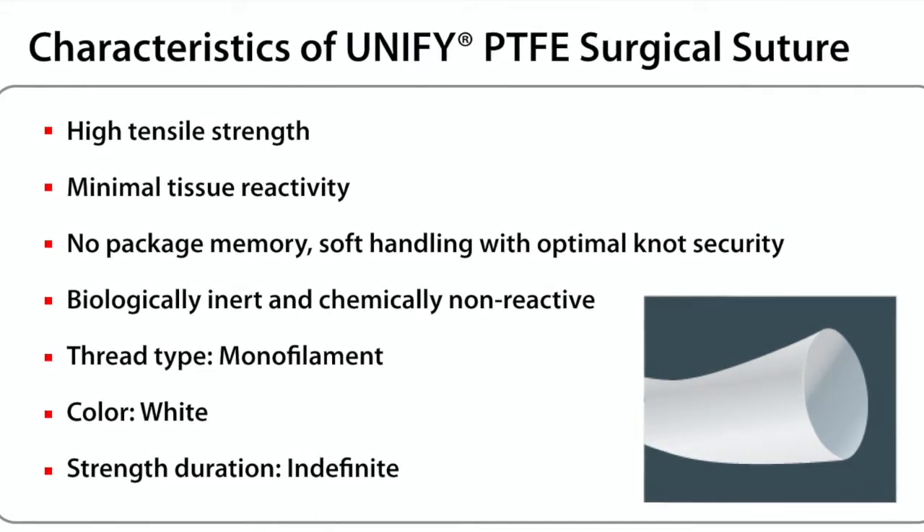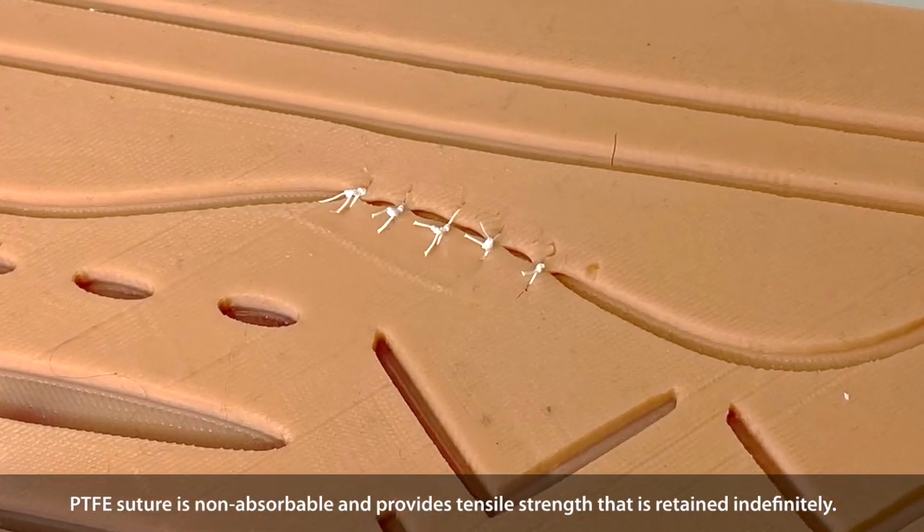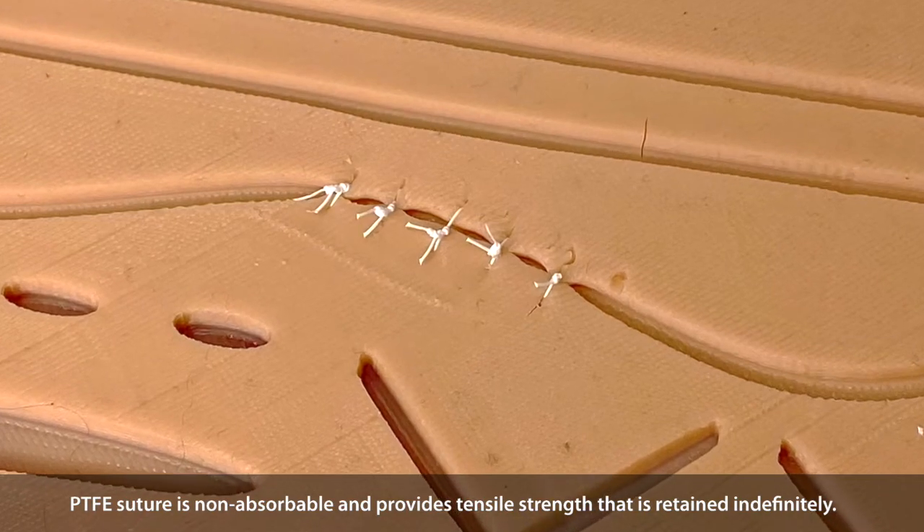The thread is monofilament in a white color. PTFE Suture is non-absorbable and provides tensile strength that is retained indefinitely.